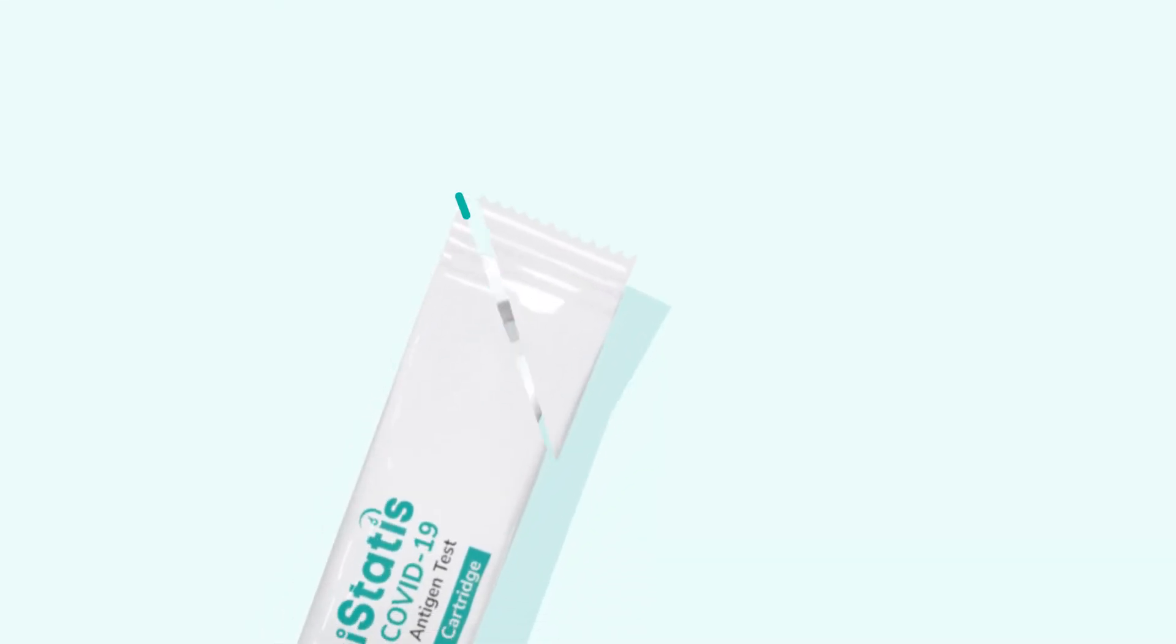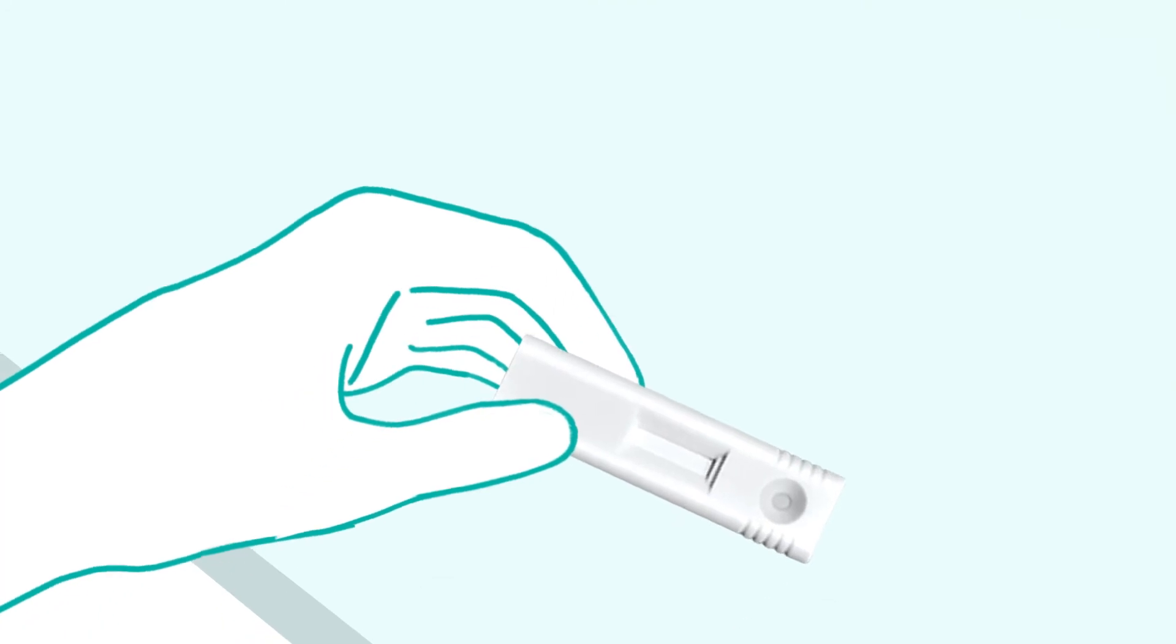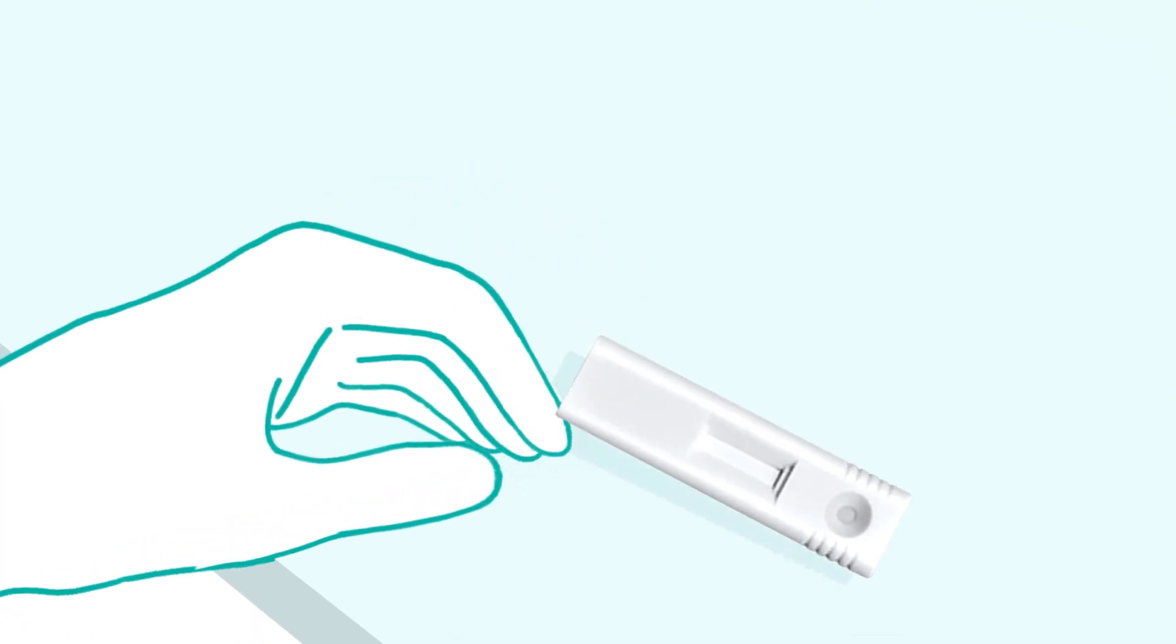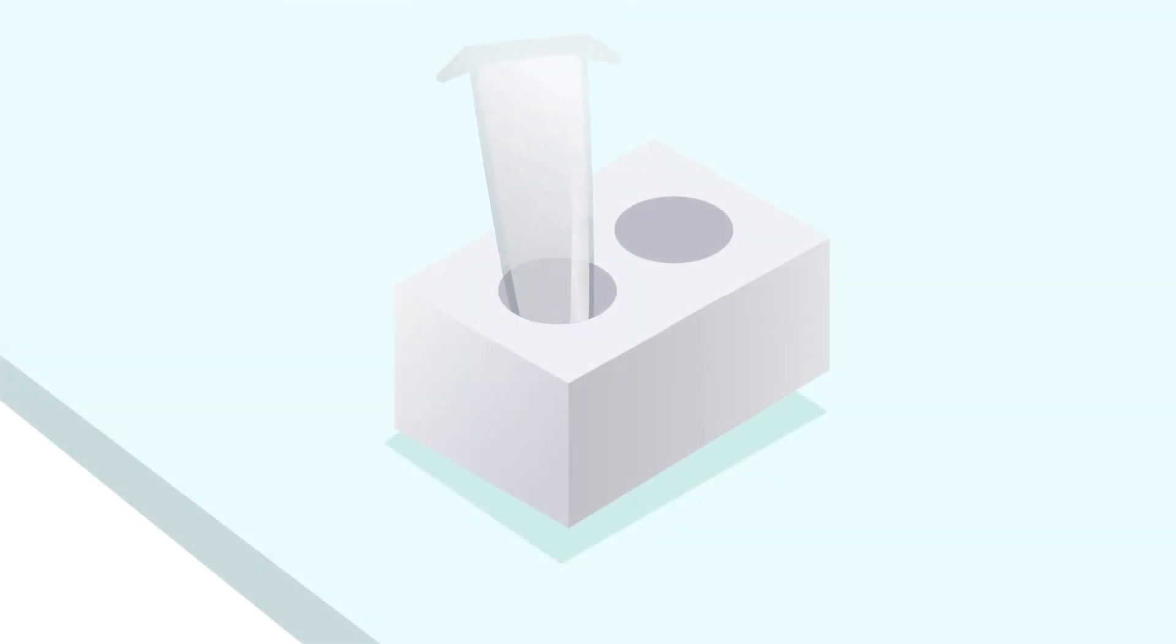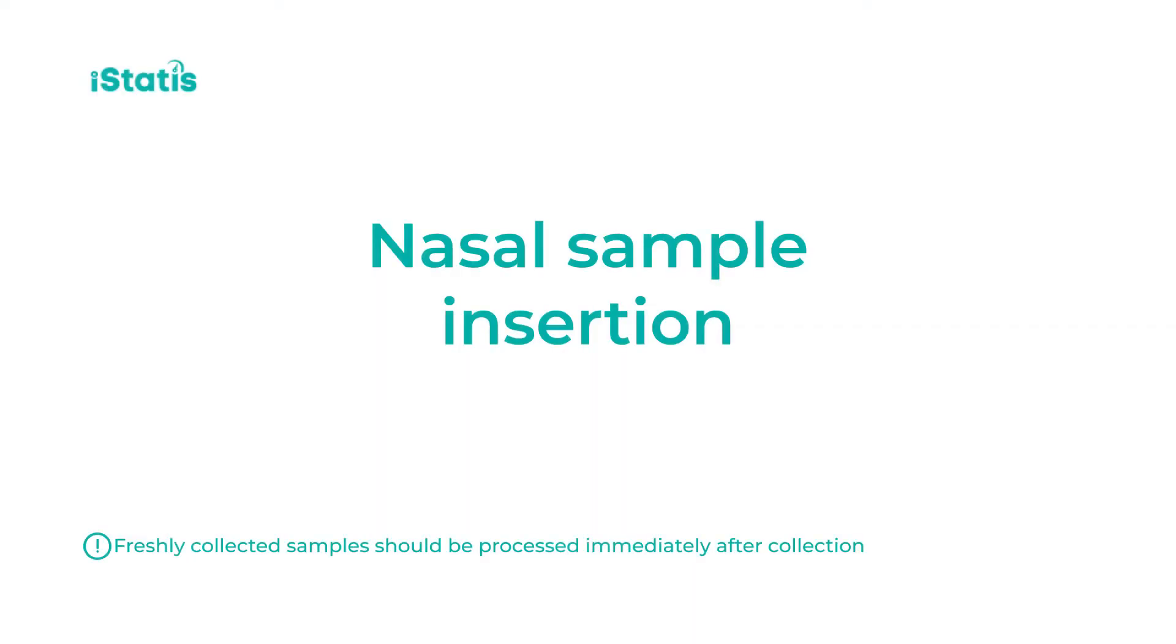Next, remove the test cartridge from its packaging and lay it flat on the table. Tear off the foil seal of the buffer vial and place the buffer vial into the vial holder.